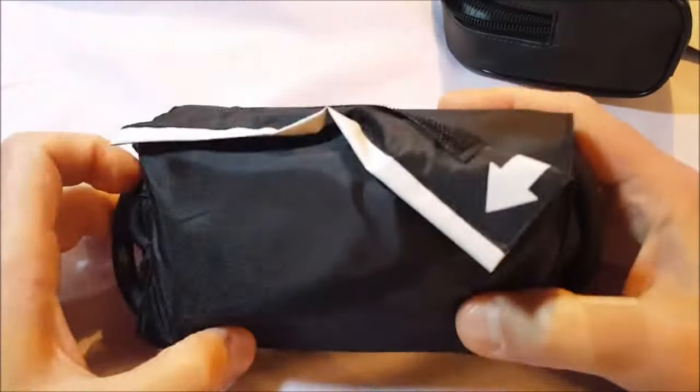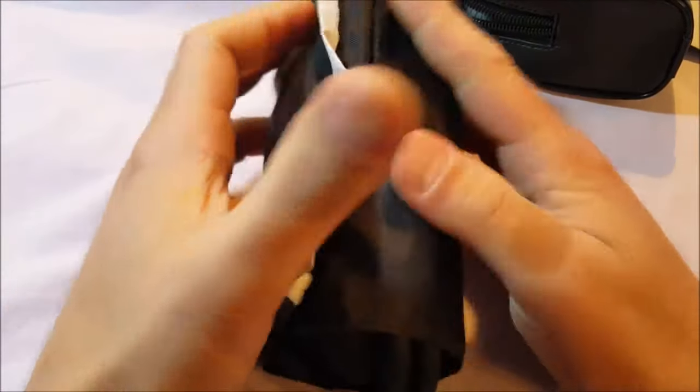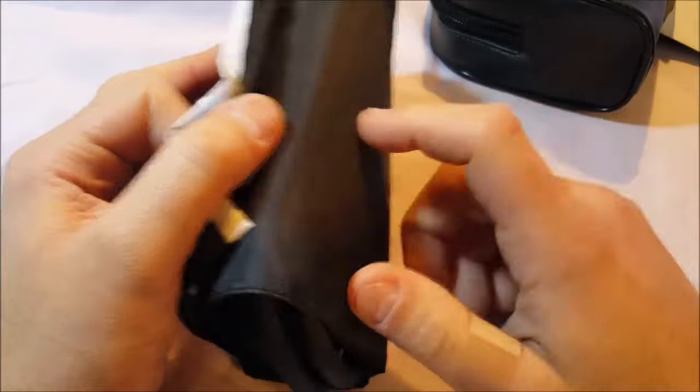Inside. Pocket style is what they call it — you can fold it up and stick it in your pocket as it were. Black cuff and matching storage case.